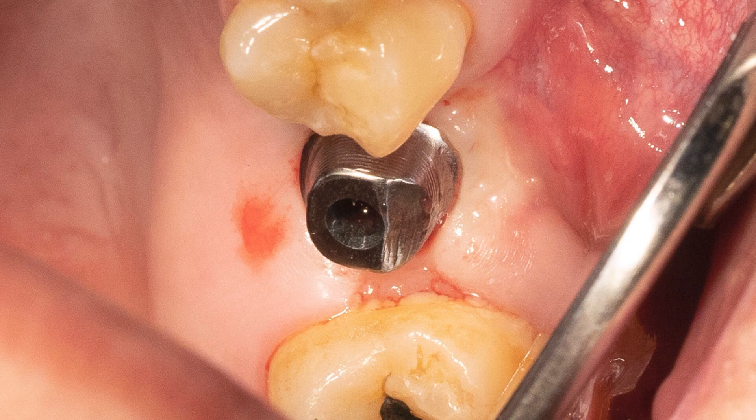Once fully seated, check if the margins of the abutment are fully exposed. Like with tooth preparations, any subgingival margins will need to be exposed for the lab to create a great fitting restoration.